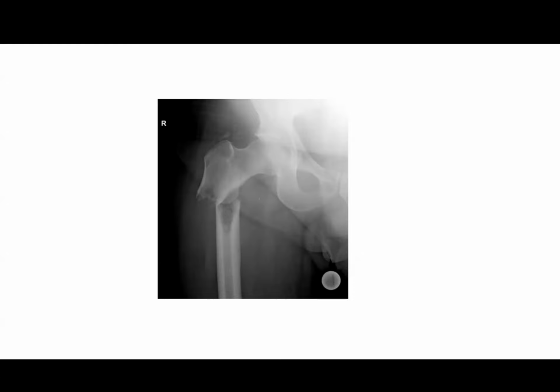I could appreciate there is a radiolucent area in the subtrochanteric area, and there is also thickening in the lateral wall of the proximal femur.